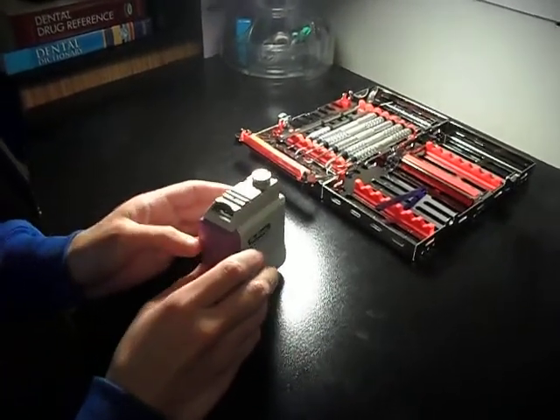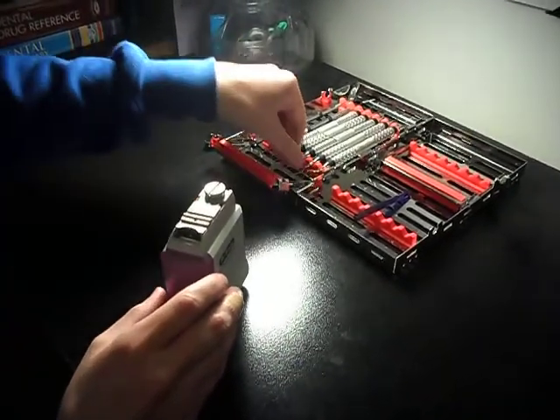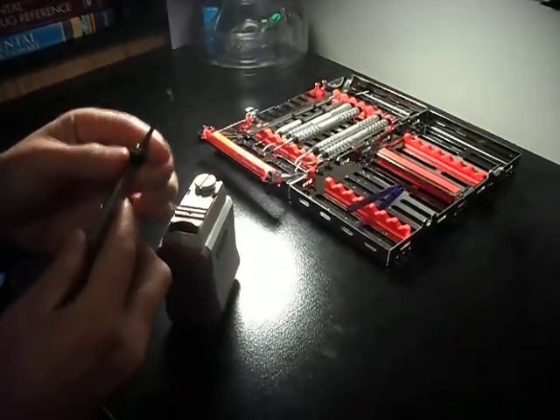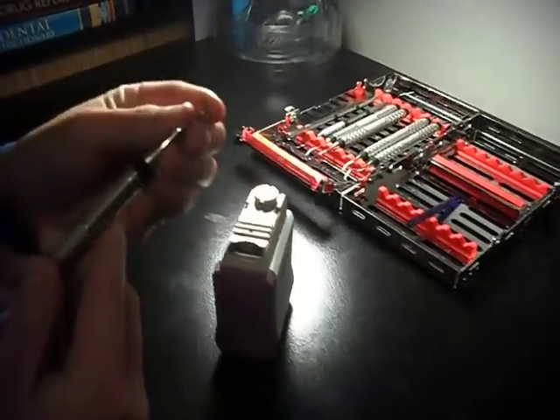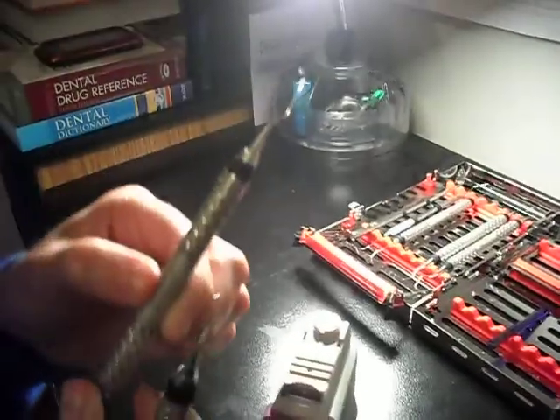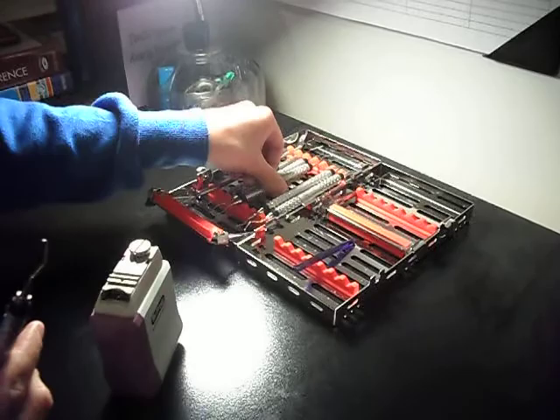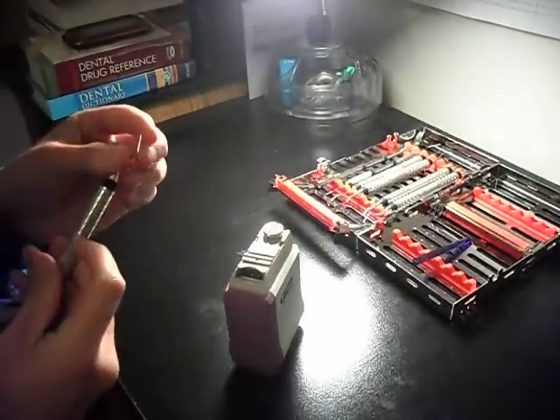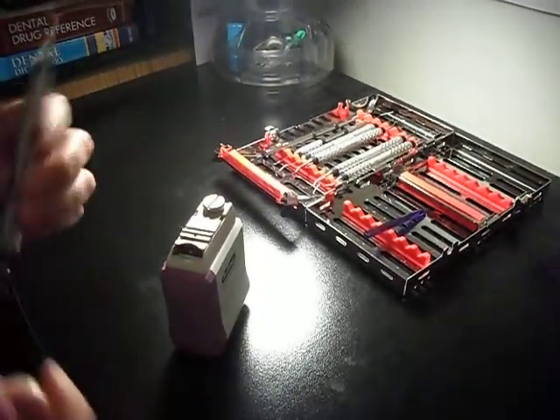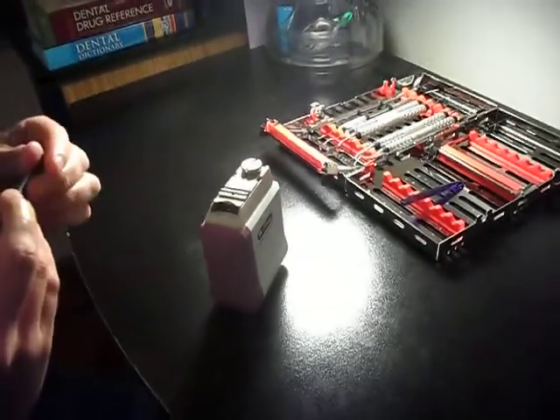When cleaning someone's teeth, there are two basic types of instruments. One type is called a supragingival scaler, and the other type is a curette. Now, after using these on someone's teeth for a long time, they get dull. So then you have to sharpen them. I'm going to demonstrate how to sharpen dental hygiene instruments.